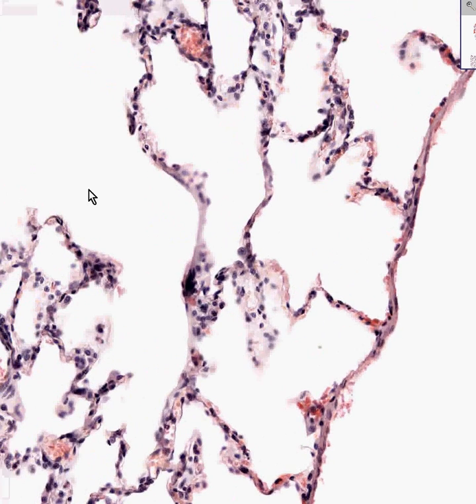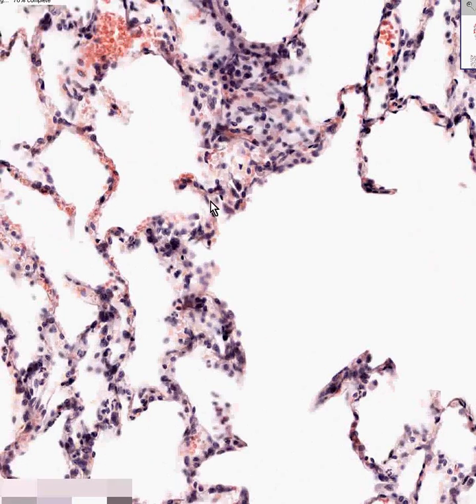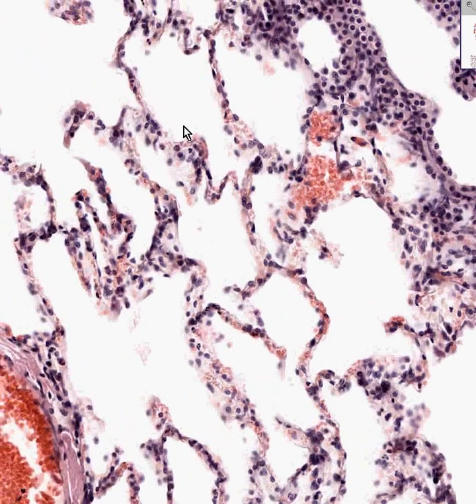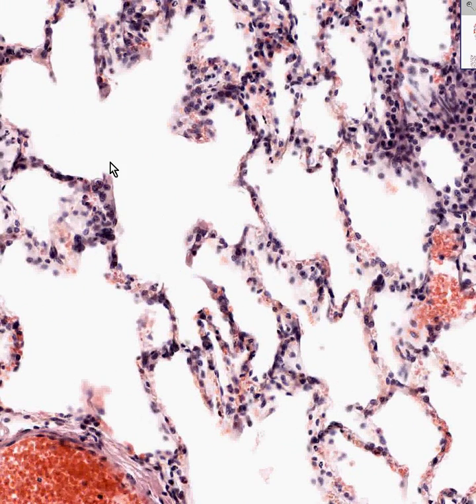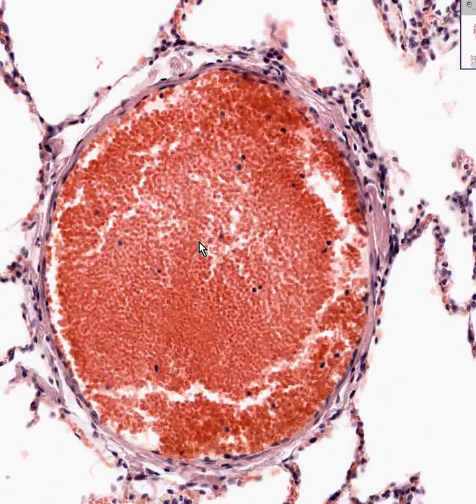We can see alveoli. We can see alveolar ducts into which multiple alveoli empty. If we saw ducts containing clearly cuboidal cells, we call those respiratory bronchioles. I don't think we really found any too easily on this slice here. This could possibly be one because these cells look very cuboidal. Otherwise, columnar cells are in the bronchi, in the bronchioles, and the rest of these structures are veins, arteries, and capillaries. And I would probably call this a vein because it has a very thin wall. But remember, the pulmonary arteries also have relatively thin walls because it's a low pressure system.